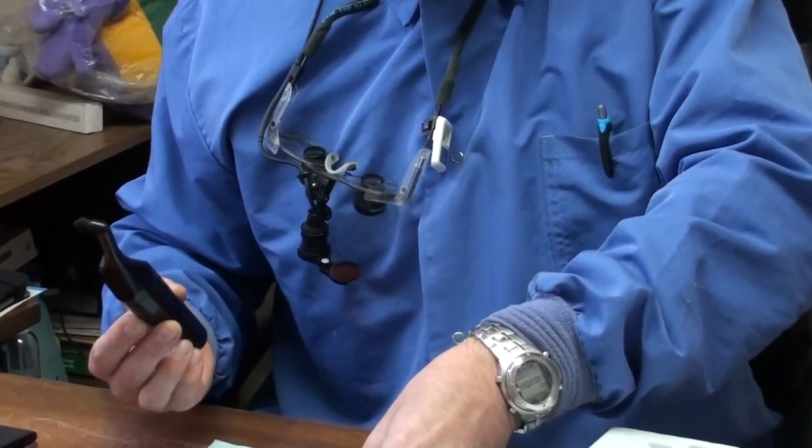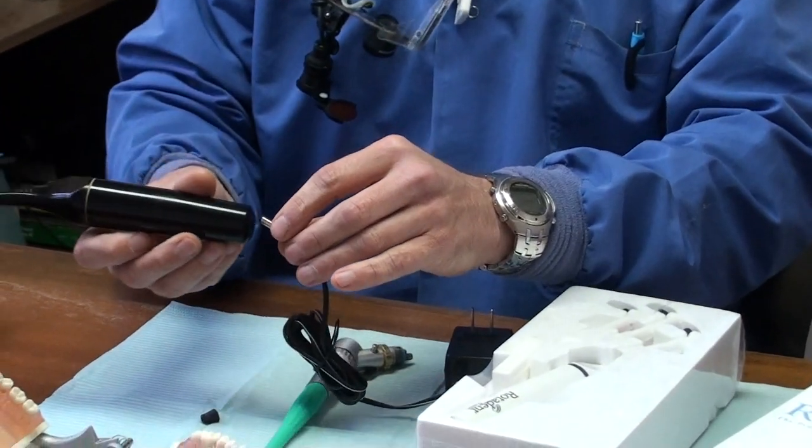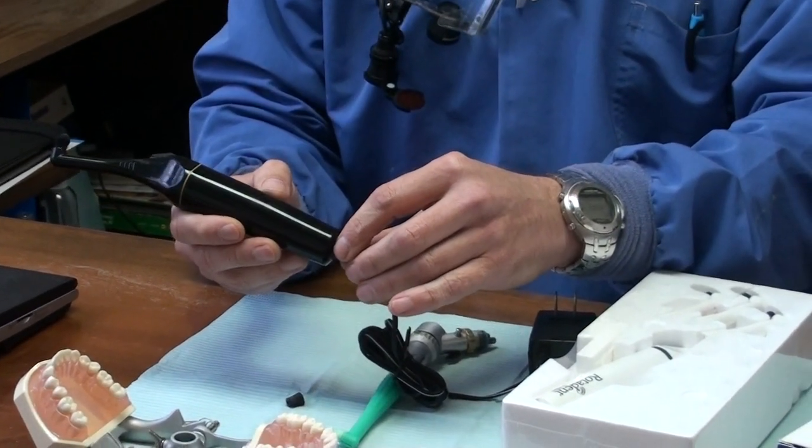The Rotodent, when it comes out of the package, needs to be charged. You charge it here on the end. You want to charge it for 24 hours.